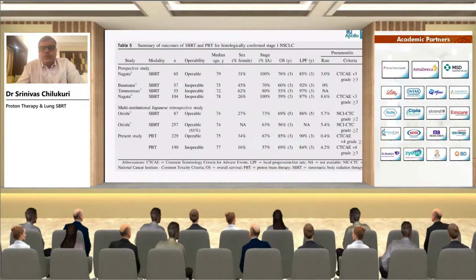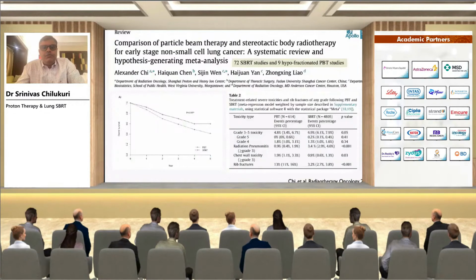much less toxicity. And this is the table where they compared conventional SBRTs in Japan and other multi-institutional series to proton beam therapy, and you see the local progression-free survival and overall survival were quite good, and the rates of pneumonitis were quite low in this group of patients.